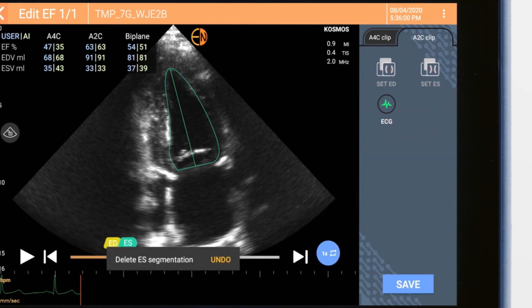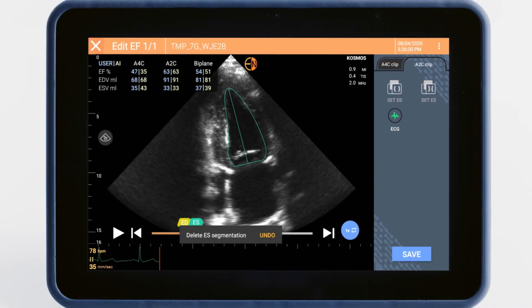To adjust the other frames, tap the corresponding tab. Once you're happy with your adjustments, tap the Save button.